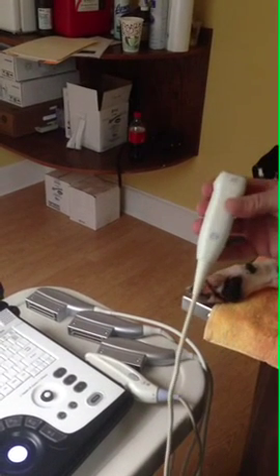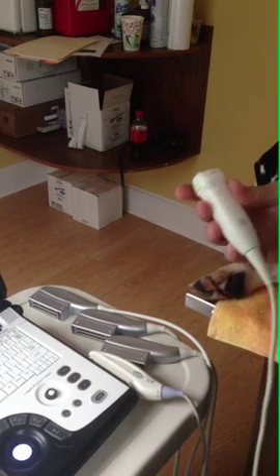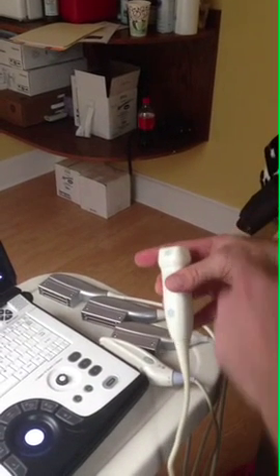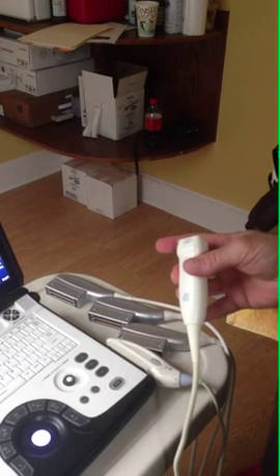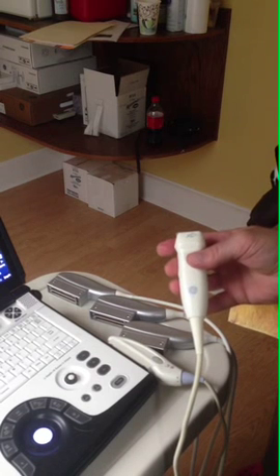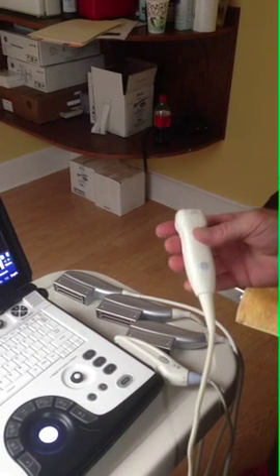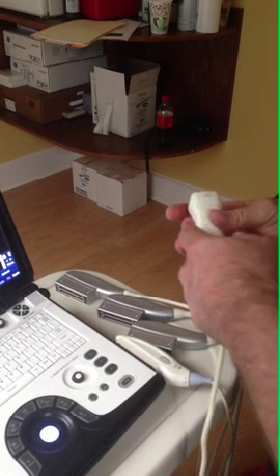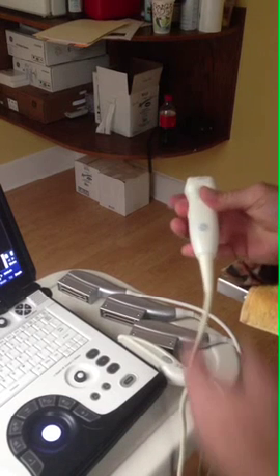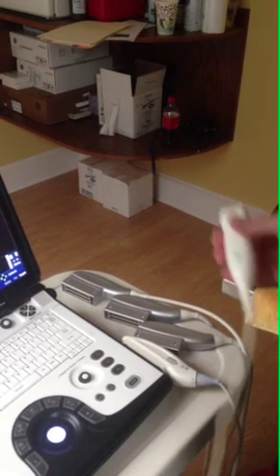This is the cardiac probe and we're going to do an echocardiogram on a Dalmatian. Hold the probe with the forefinger right above the probe and use this to collapse the lung to open up the window to perform the echocardiogram more easily. Use the middle finger on the cursor and the thumb, and use the little finger to balance the probe and keep the axis in the right position.